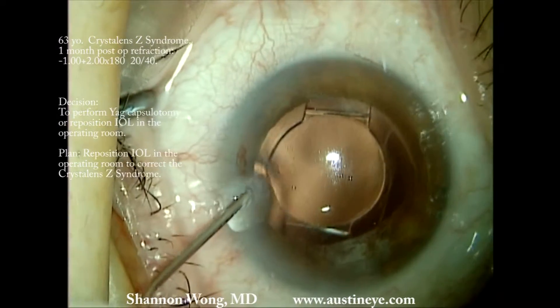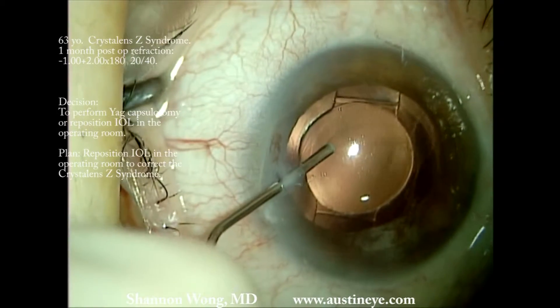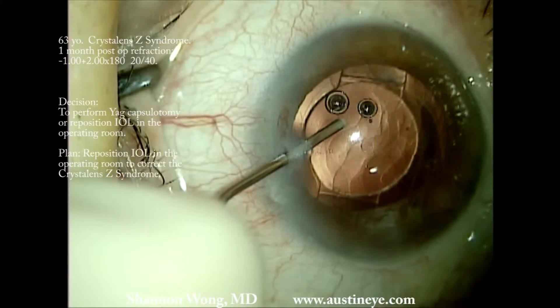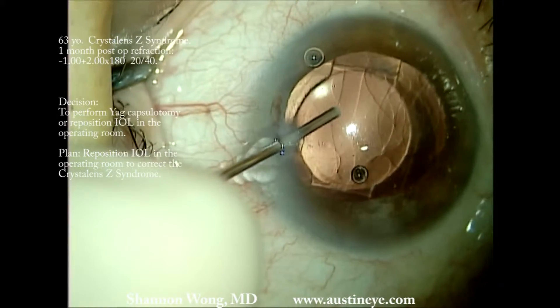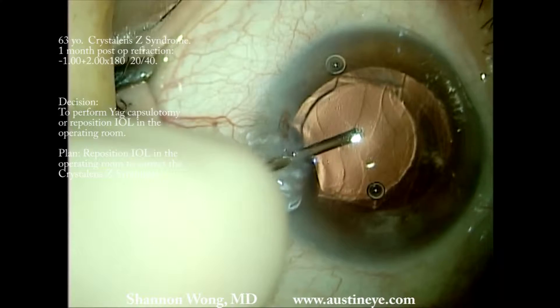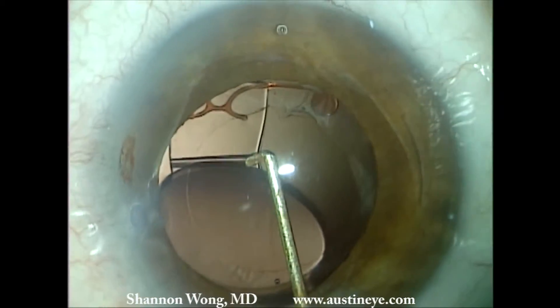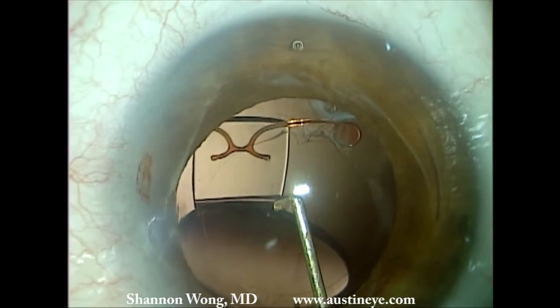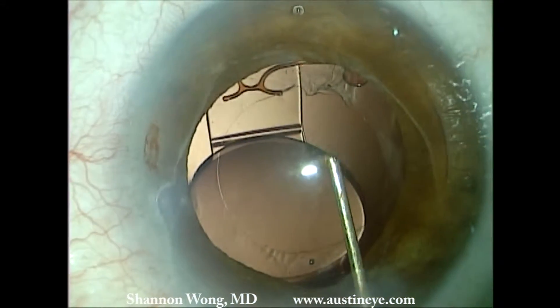The first thing we do is inflate the eye with Helon-GV viscoelastic and re-expand the capsular bag. The top portion of the screen shows the nasal haptic and the bottom portion of the screen shows the temporal haptic.